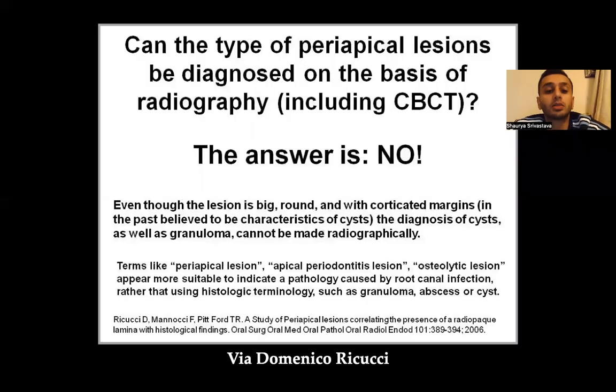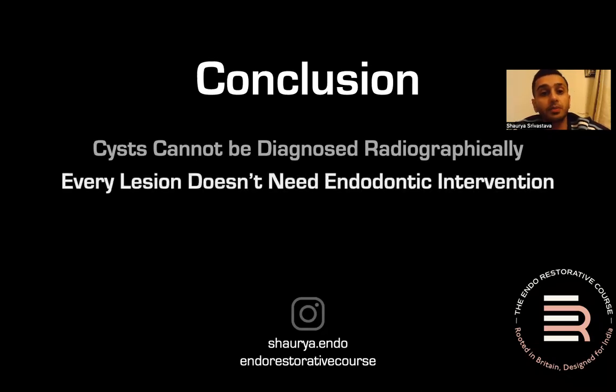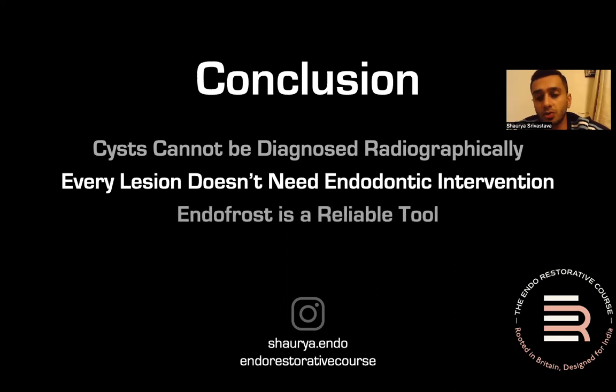Okay. So the conclusion of this here, based on evidence, going back to the same paper: can you diagnose a cyst radiographically, including the CBCT? And the answer is no. Right? So a cyst cannot be diagnosed radiographically. Every lesion doesn't need endodontic intervention. Endofrost is a reliable tool. That's a sensibility testing.